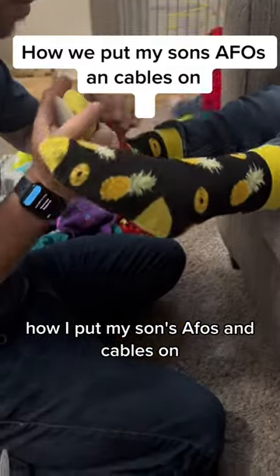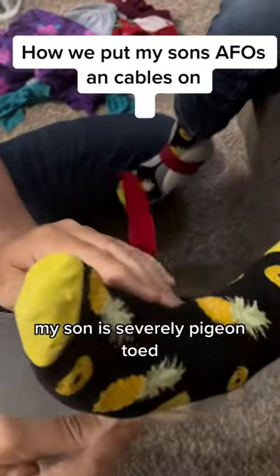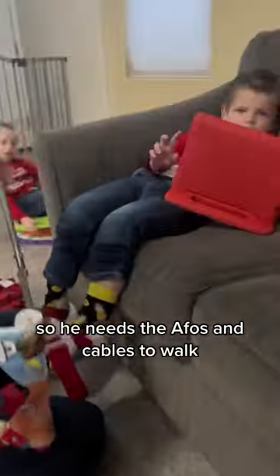How we put my son's AFOs and cables on. My son is severely pigeon-toed. He has Angelman syndrome, which gives him a balance disorder, so he needs the AFOs and cables to walk.